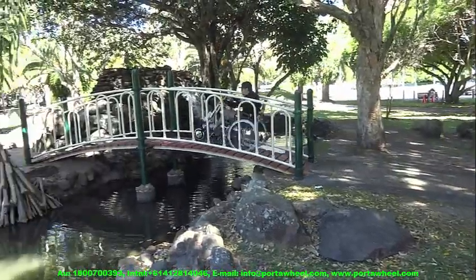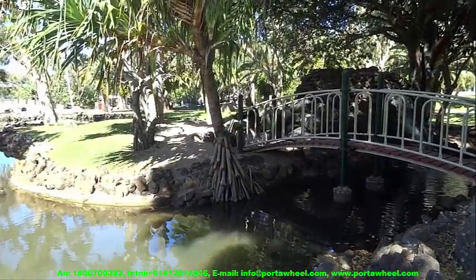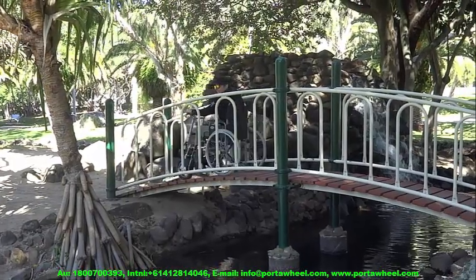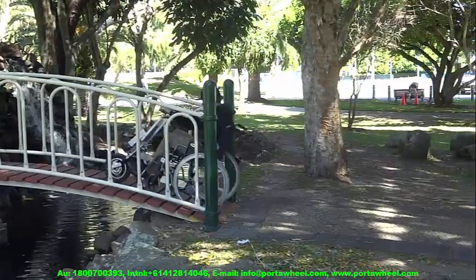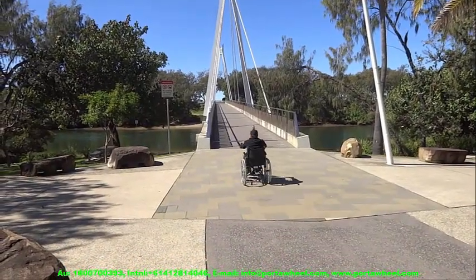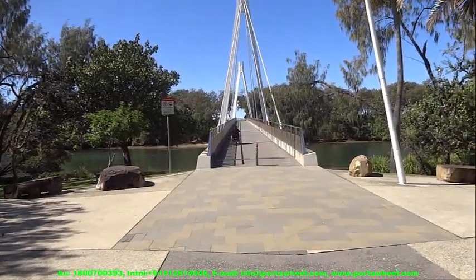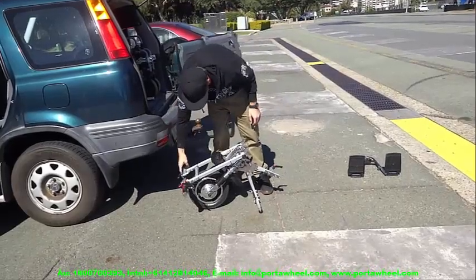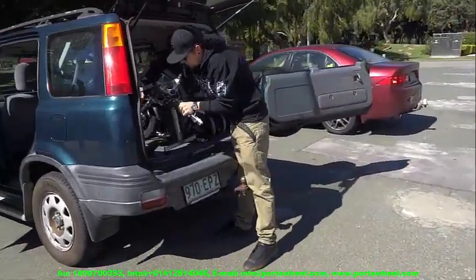Next we move on to the PortaWheel Power Assist add-on for manual wheelchairs, starting with the PortaWheel 380 — the 380 indicating the wattage of the brushless hub motor. This incredible add-on turns any normal manual wheelchair into the most powerful and flexible electric tricycle you can imagine, and it easily folds up and only weighs 10kg or 22lbs, making it very easy to unhitch and lift into the car boot or take on the plane for international travel.